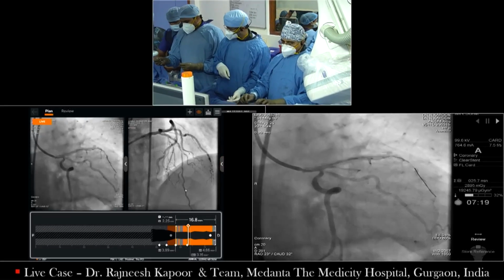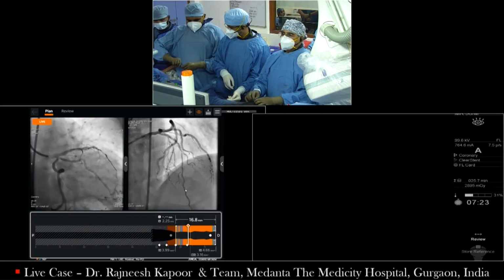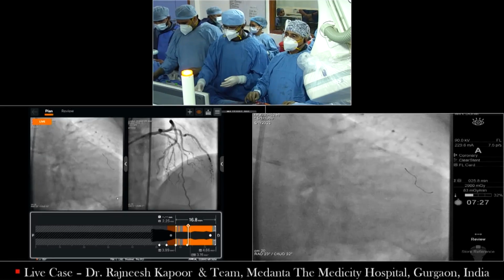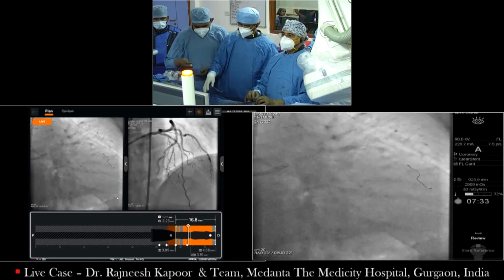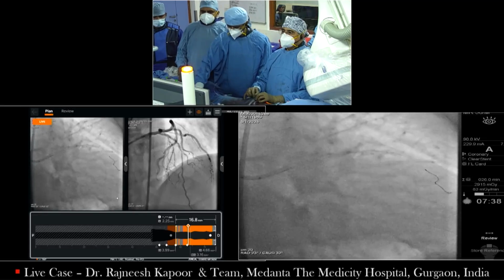So this is almost our second or third case of non-crossable with orbital. As dictum, it's rota, but somehow we got stranded in one more patient like this where it was non-crossable. This is 3.0. I agree with you.